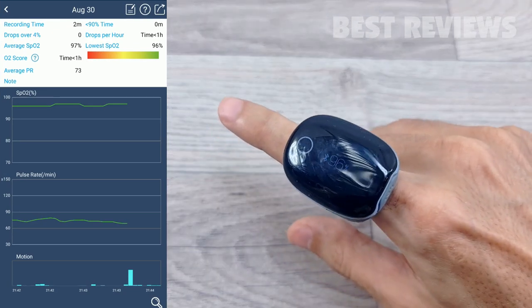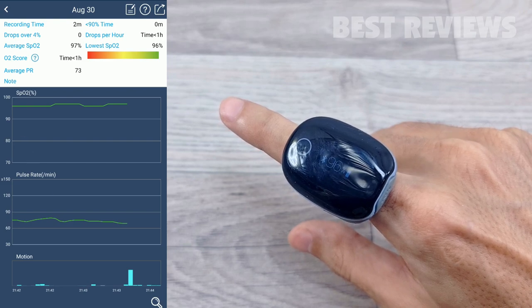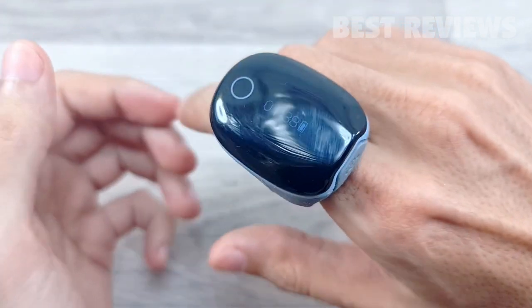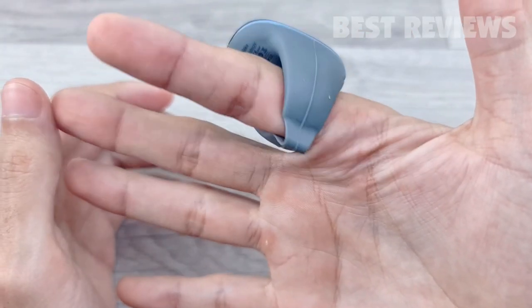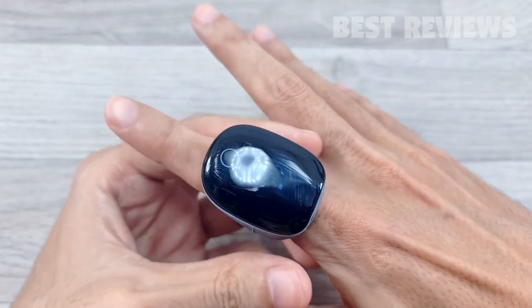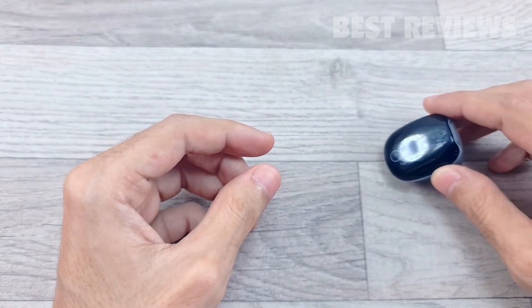The History section works on the basis of user sessions. Every time you use the Ring, it stores the data internally, then in the morning, or whenever you next connect via Bluetooth to your phone, the Ring automatically uploads your sleep data, syncing it with the app for display and analysis.